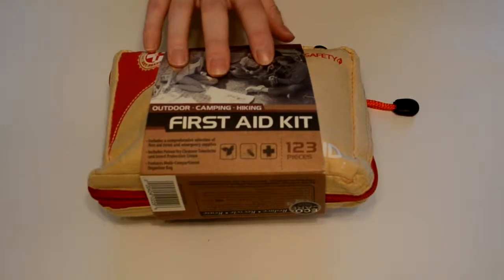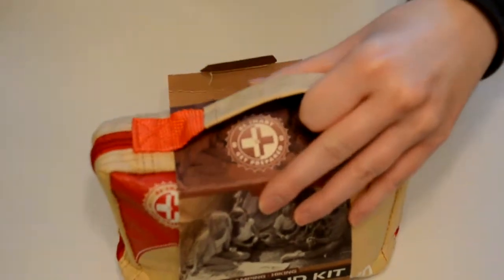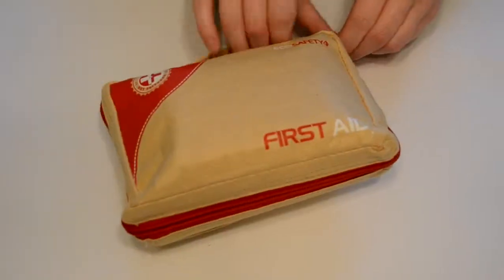It's 123 pieces, so first I'm just going to use the scissors to cut a little piece of tape that was holding it together, and then we're going to see what's inside.